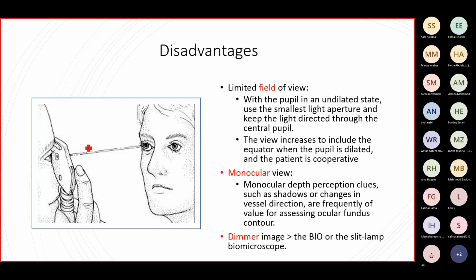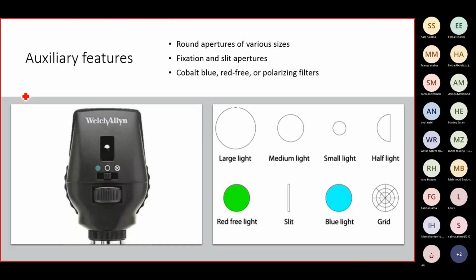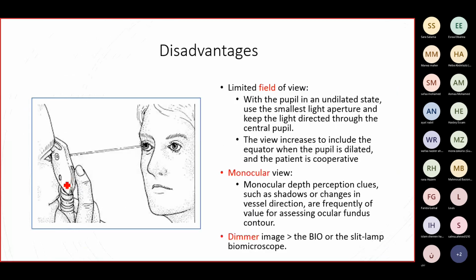You may want to focus on the top of the lesion, the summit, and check what dioptric power you used, and then focus on the retina itself and check the dioptric power. The larger the dioptric power difference between the summit and the floor of the lesion, the higher this lesion will be. Okay.